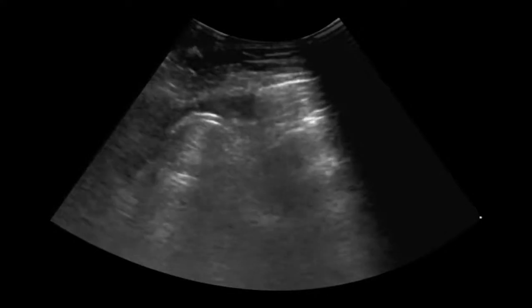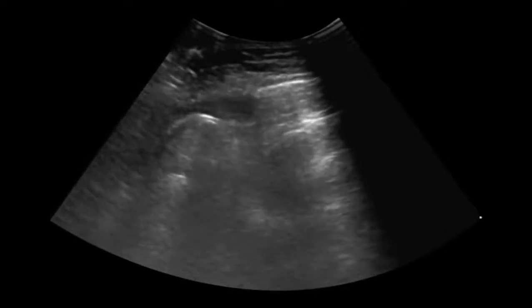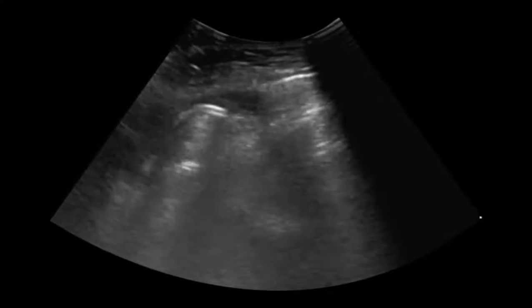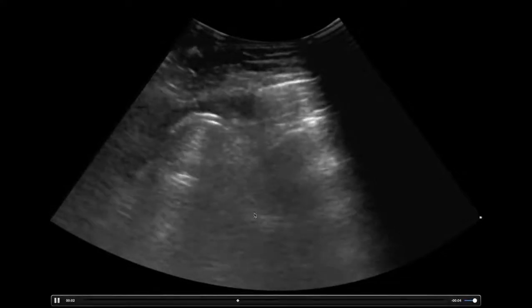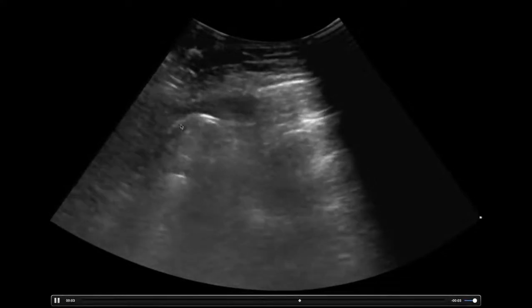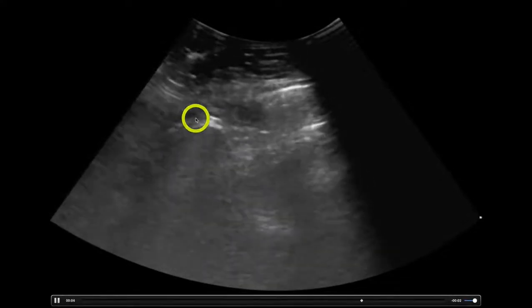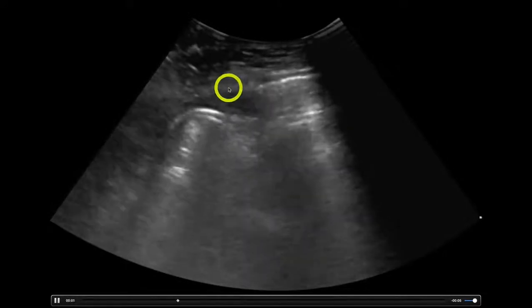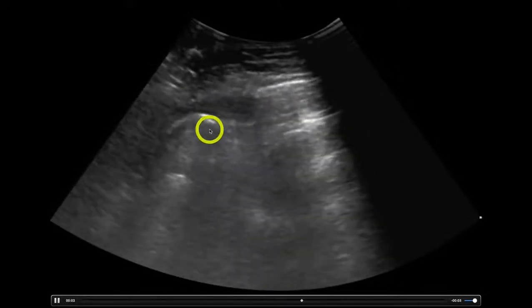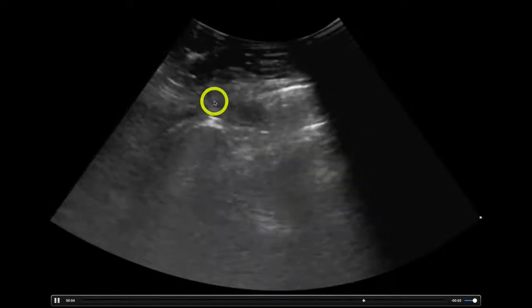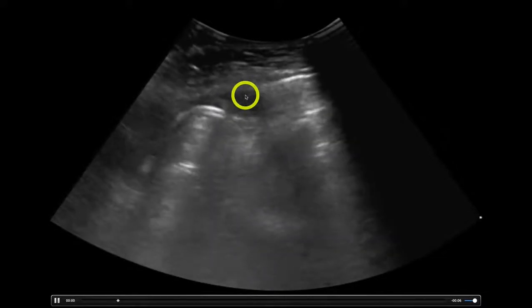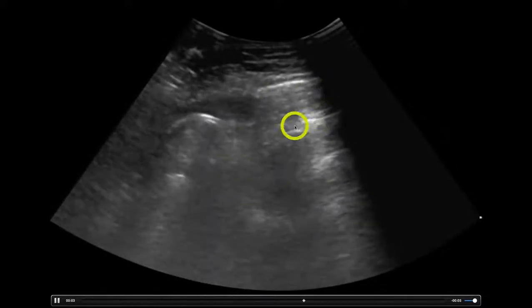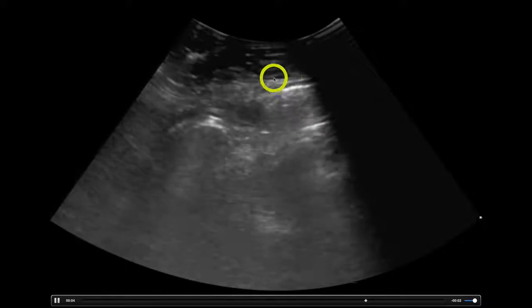You can use the curvilinear transducer although it's probably not my favorite and probably not the best. You can use it to sometimes get a little bit of a bird's eye view. Here we have air within the bowel — it's below the peritoneal stripe right there, so this is not free air. This is the peritoneal stripe and then right here we start to see an enhanced peritoneal stripe with some A lines behind it.